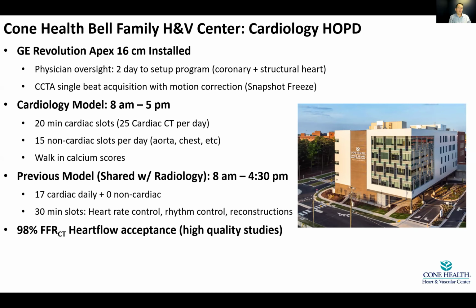But I think the key part is we're not limited by the technology, the technologists. We're able to maximize the scanner with our selection and what we have currently. And in addition to those 40, we're doing walk-in calcium scores. And that just speaks to how efficient we've been able to become with that system.